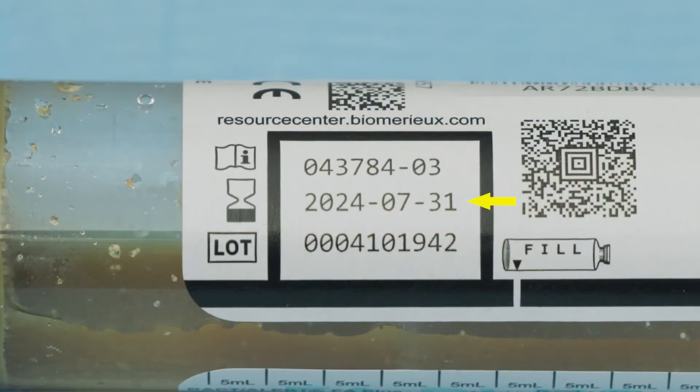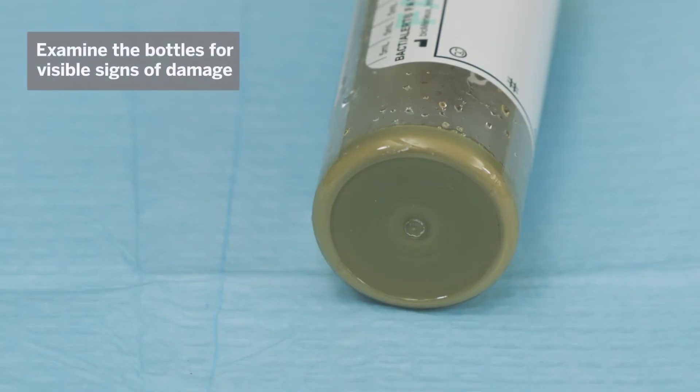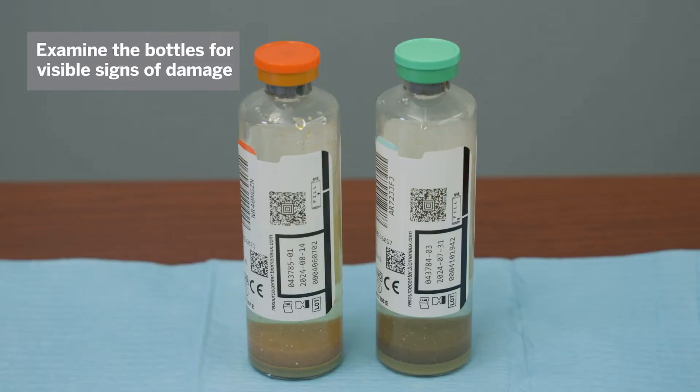Check that the culture bottles are within the expiration date. Do not use a bottle containing media displaying turbidity, a yellow sensor, or any other visible defects. Do not use bottles that show signs of damage, deterioration, or leakage.